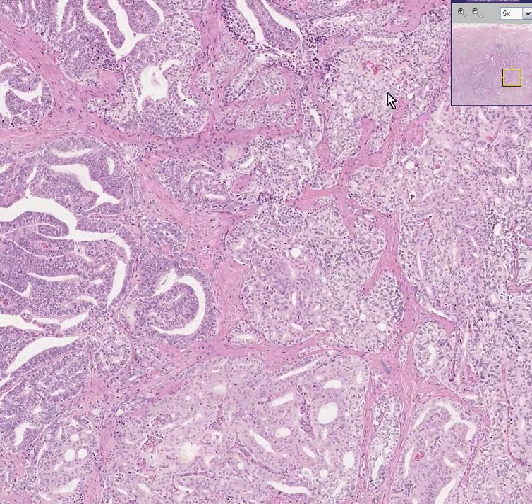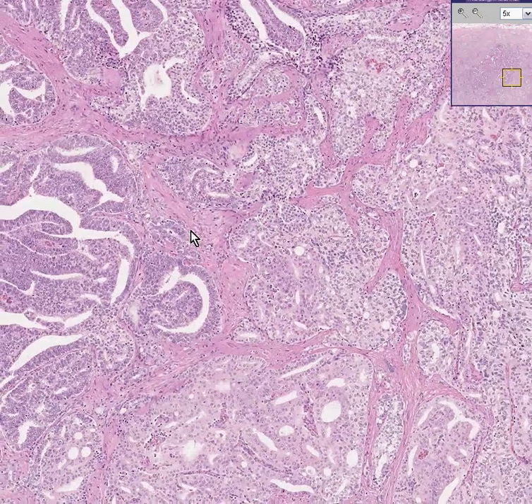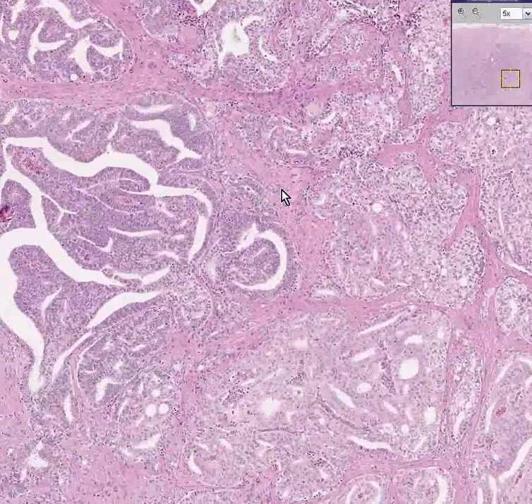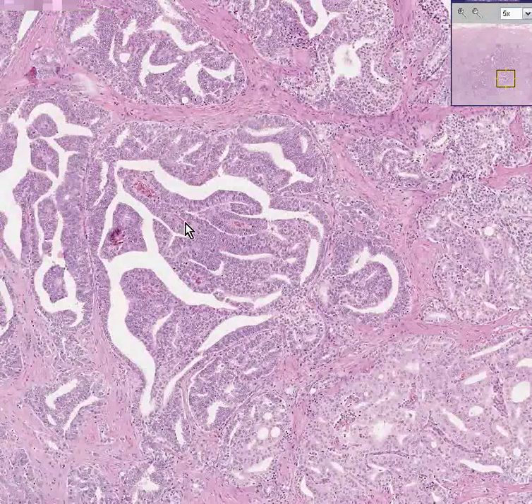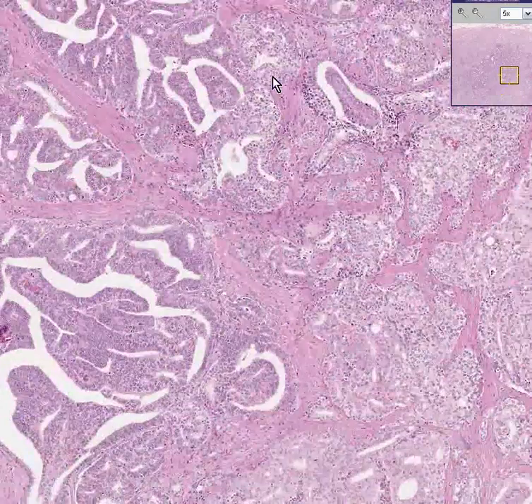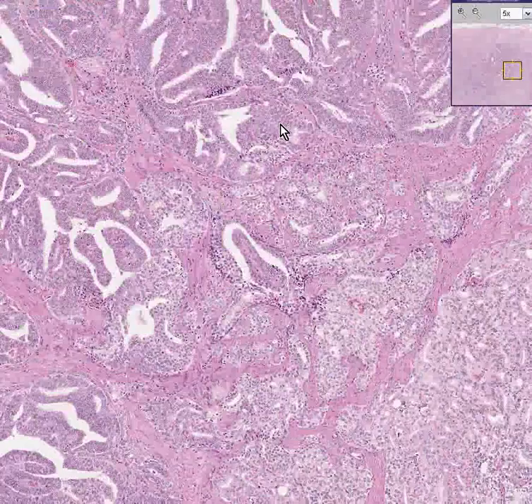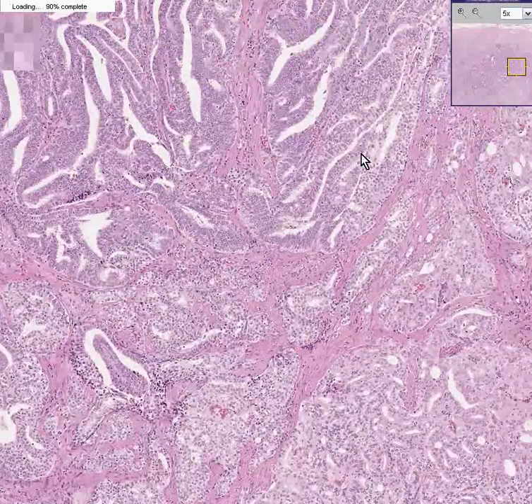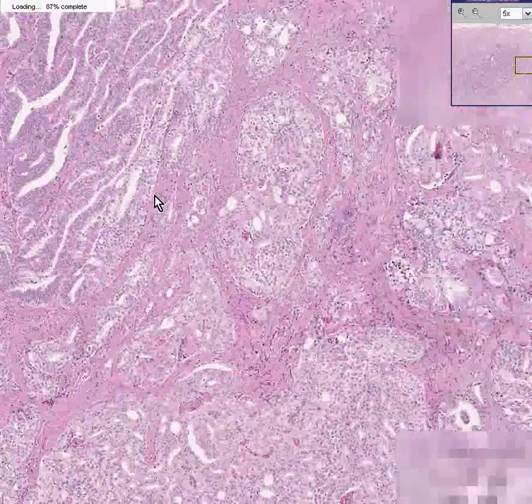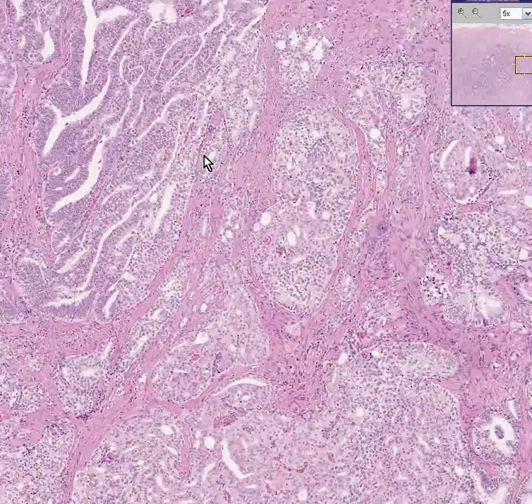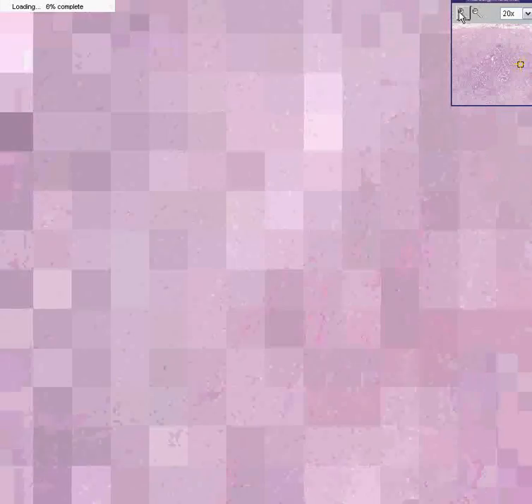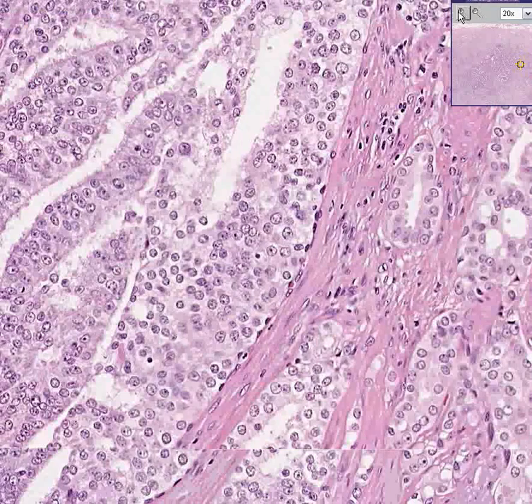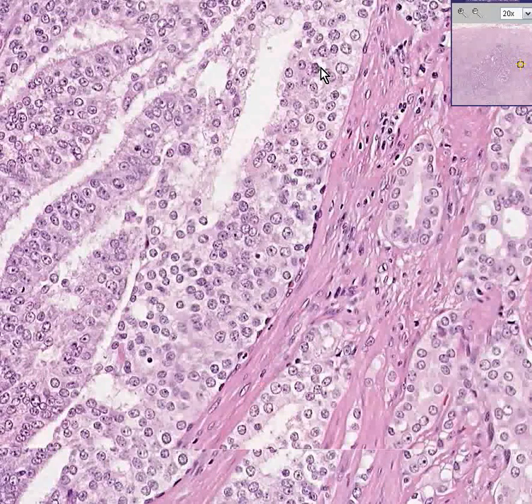Notice there is very little attempt at glandular formation. Notice there's almost a papillary type structure here. Notice once again these glands are poorly differentiated, haphazard, irregularly invading the surrounding tissue. But also, especially with prostate, notice once again that almost all of these cells have nucleoli.